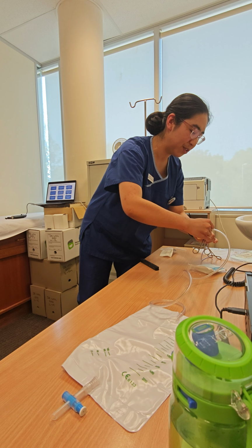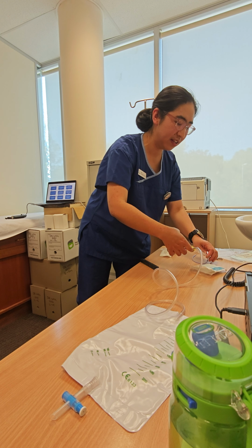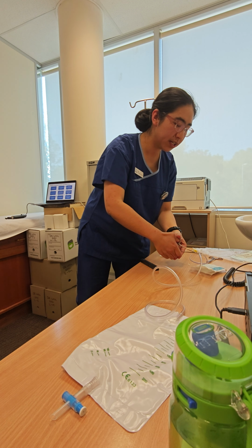In this demonstration, you shouldn't touch anything in the sterile place. But make sure this time it's all clamped on. And if it's all tight, you can just remove.